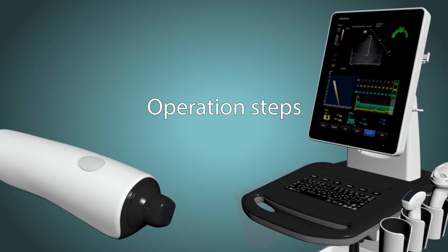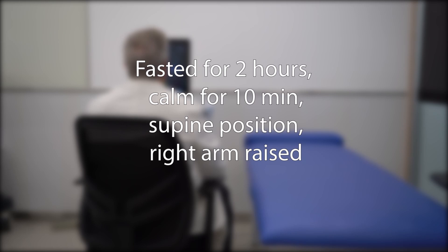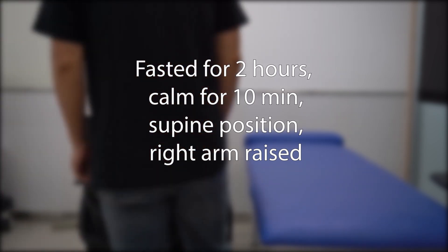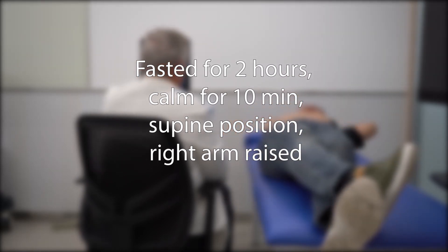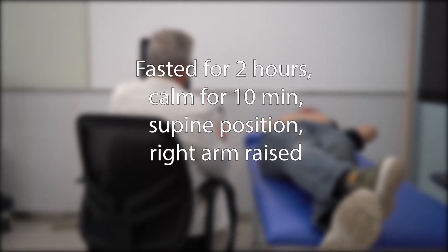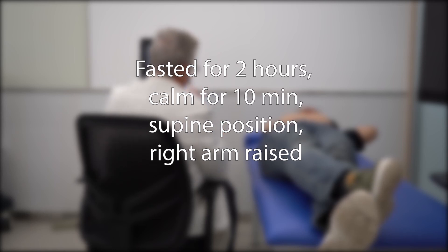Now let's get started on how to use the system. First, you'll need to make sure the patient has been fasting for at least two hours. The first thing to do is ask the patient to relax, stay calm for about 10 minutes, laying down on the bed or stretcher.